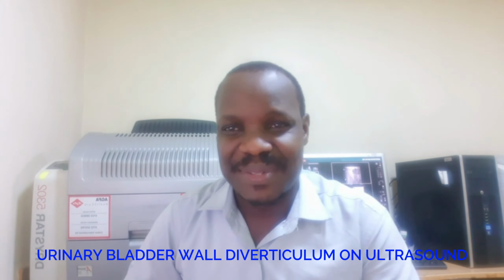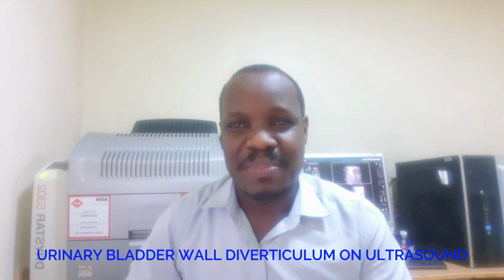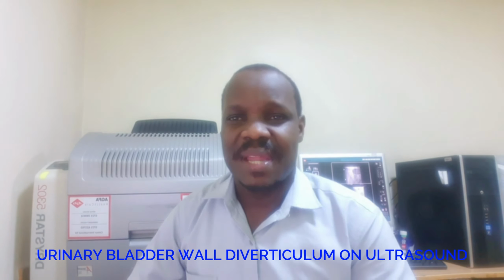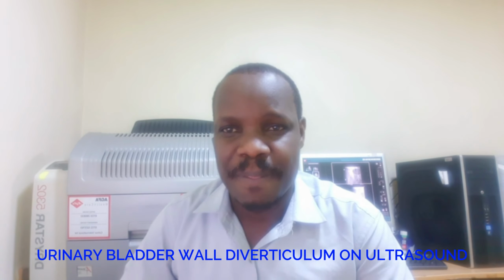Hi everyone, today let's talk about something called urinary bladder diverticulum, and let's define what it is. It's an outpouching on the wall of the urinary bladder. What happens is there's a breakage, an opening in the muscular layer of the bladder, and sometimes urine flows into this opening and forms a pouch where the urine is trapped.